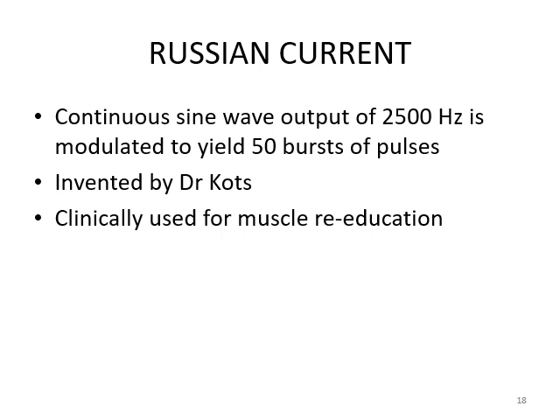Because its primary intention is muscle contraction, they are indicated for muscle re-education and muscle strengthening.